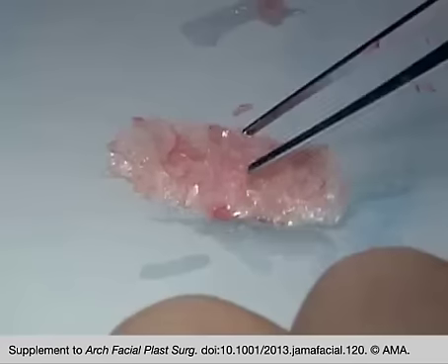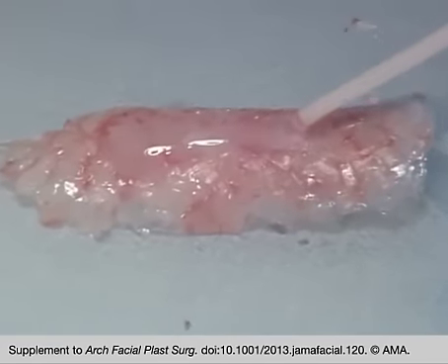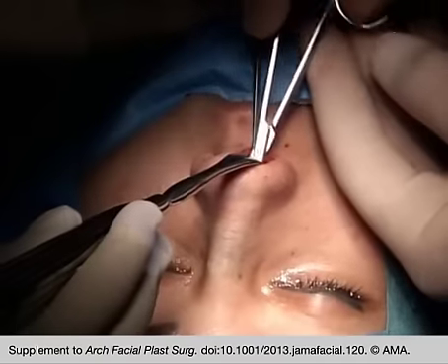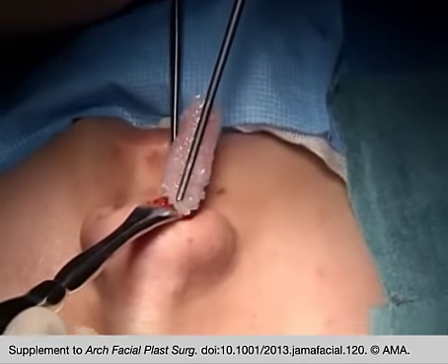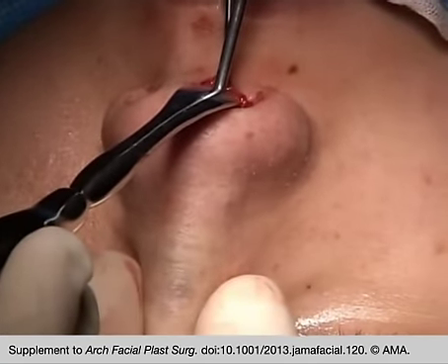Excess glue may be trimmed and the convex face of the graft is covered with a few drops of fibrinogen. The semi-rigid graft is elastic but must be inserted without compression. Access to the dorsum and the recipient bed must therefore be large enough.